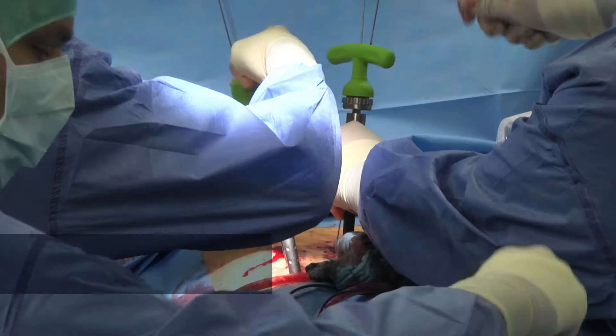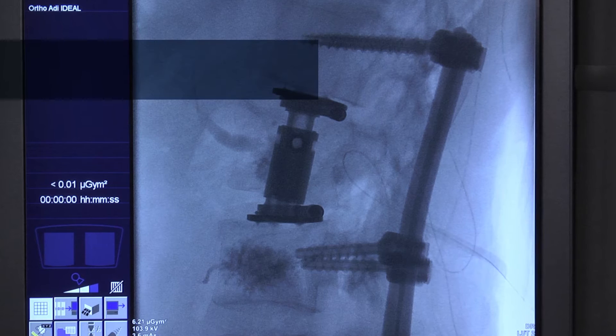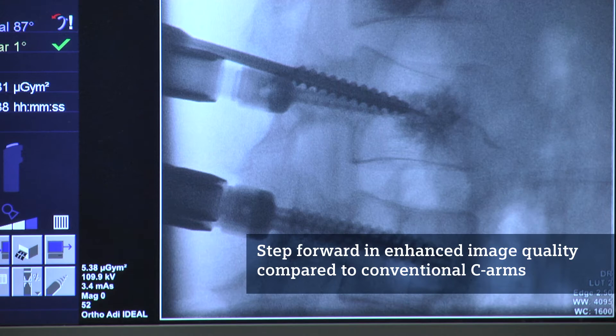We have been using the Seuss Fusion for a while and did a number of cases with it. I'm always impressed about the image quality of that C-Arm — this is absolutely new and tremendous. We hadn't that image quality before in our theatres. We can see the bony structure very precisely and also the implant positioning, and especially the interface between bone and implant is absolutely sharp and very nice to detect.